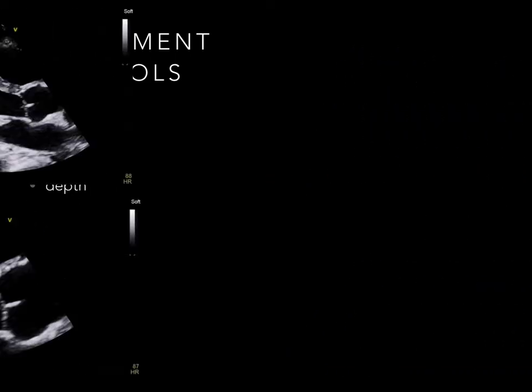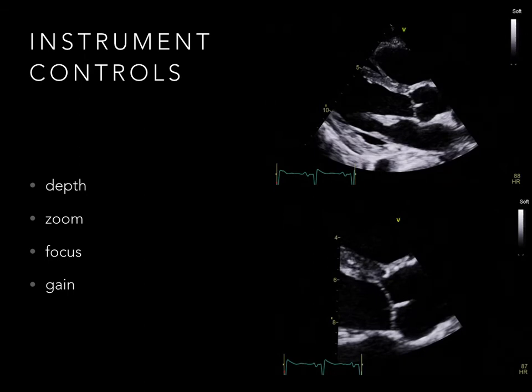Each machine has a function where you can zoom in or magnify a specific region of interest. Write zoom means magnification occurs during data collection. This improves spatial resolution because there are more pixels per unit area. Read zoom means that magnification occurs after data collection. This doesn't improve spatial resolution any further.